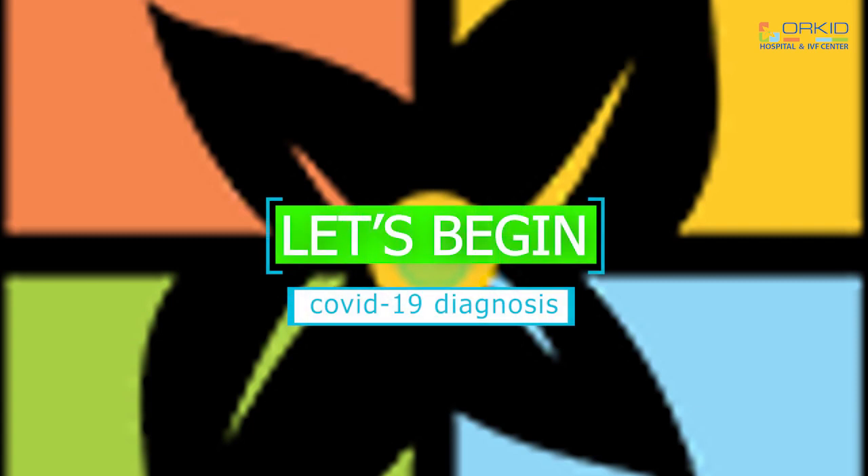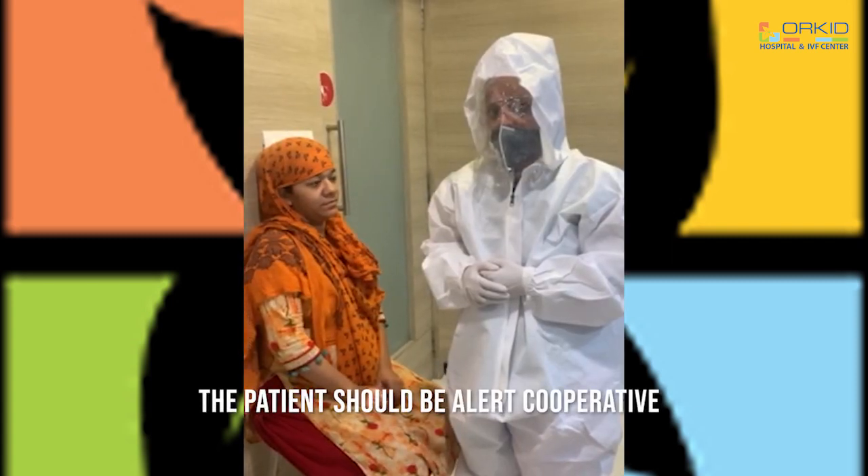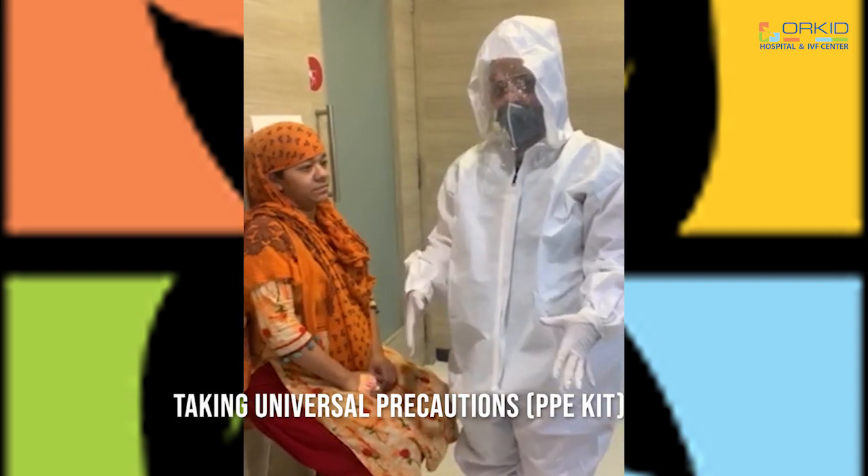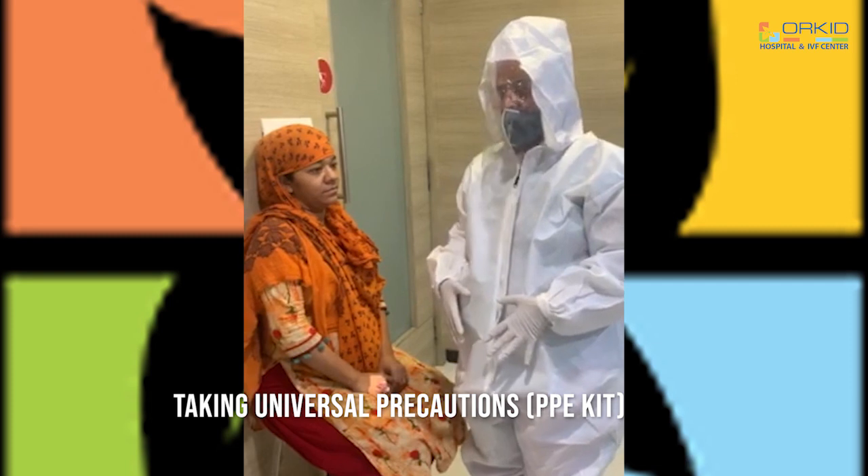Let's begin with the procedure. First of all, wear all the universal precautions — the PPE kit I am wearing. After that, counsel the patient regarding the procedure.